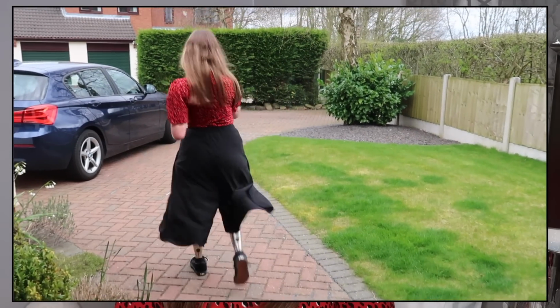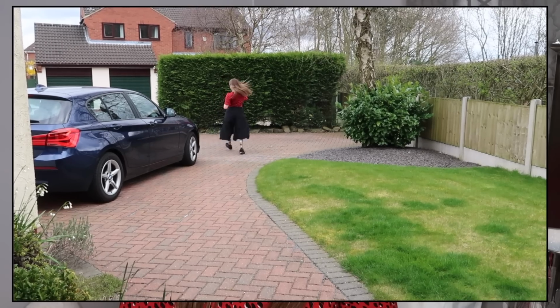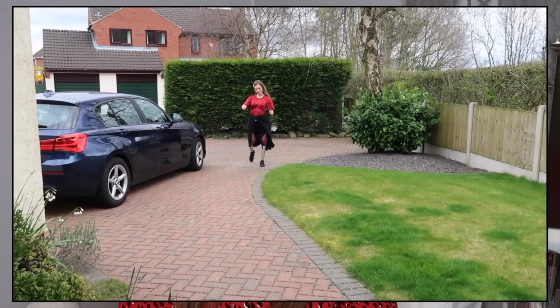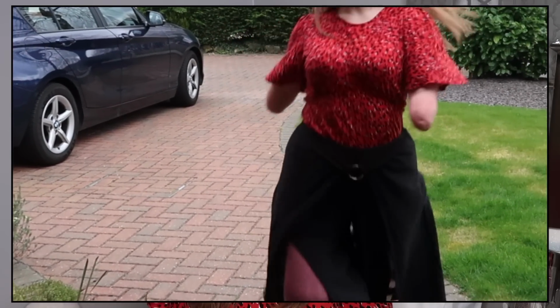So basically how I do it, I'll explain it, but obviously you can watch in the clip. You basically just walk normally really. When your foot goes on the toe, it bends the knee, and then as you bring your leg forward, it slowly straightens it and kicks through. So when you go on the heel, it's straight again, and then you can put your weight through it, and then once you go on the toe again, it bends. So it's basically like that.